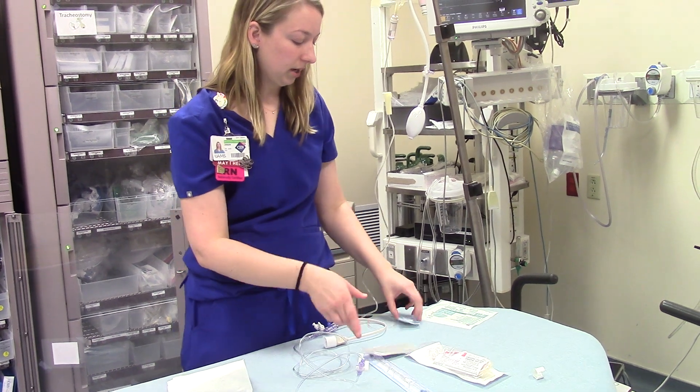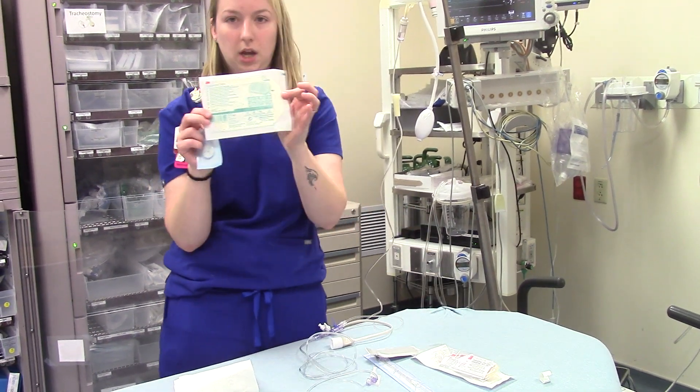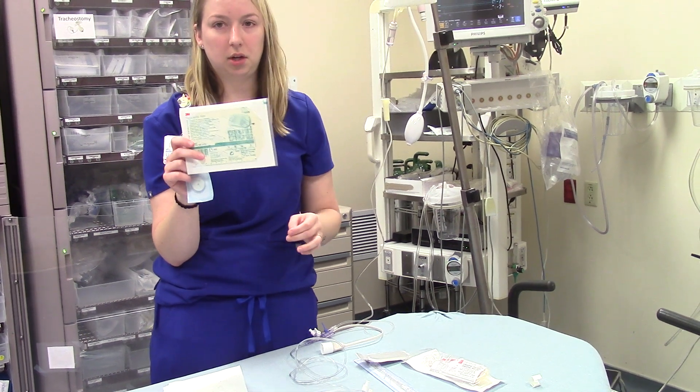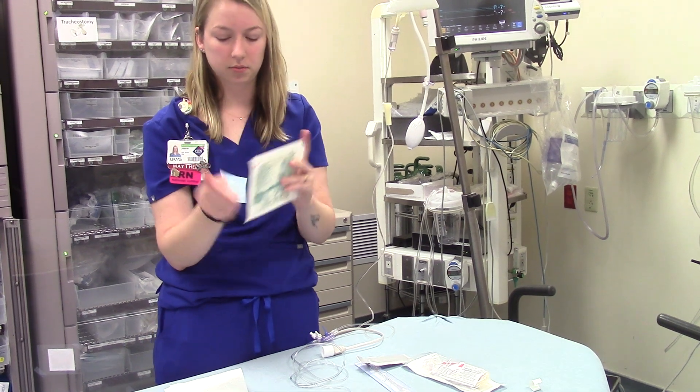The physician will usually sew it in place and then put a bio patch over it, and then one of the large tegaderms. These larger tegaderms are better for securing everything than the small ones, but you could use a small one in a pinch. These should be in all of your supply carts and in your trauma rooms as well.